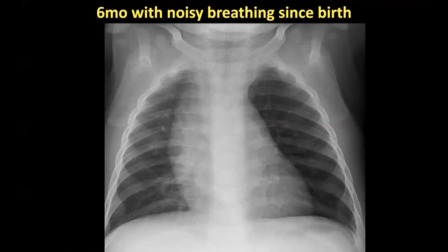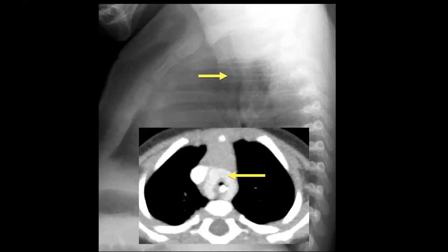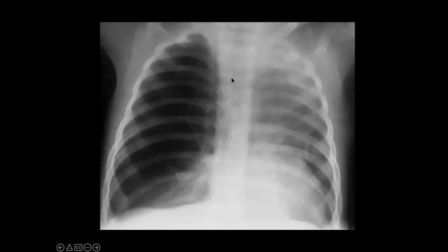This patient had a long history of wheezing — actually stridor, when you ask the mother carefully. On the AP we can see the lucent left lung. We can't always see the airways, which is why we need to look at the lateral. Remember: two parallel lucent tubes on the lateral — the trachea and esophagus. We need a straight trachea with parallel walls, and in this case we don't. In a patient with a lucent lung and a history of stridor, we need to consider a vascular ring. The CT showed a double aortic arch with anterior compression.